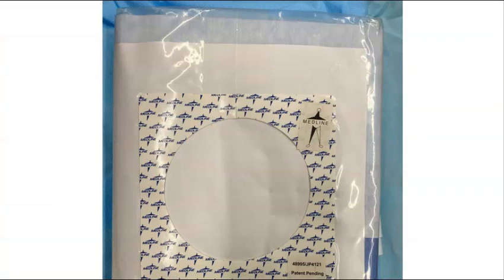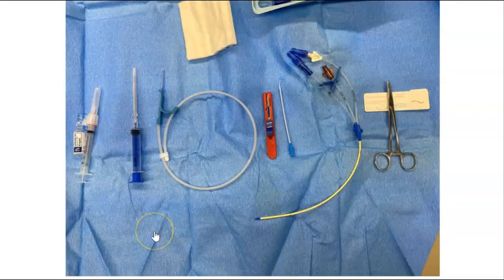Now that we have the patient positioned and found the best location for a central line, you will put on your gloves, gown, and hairnet using proper sterile technique. You will also place a sterile drape from your line insertion tray on the patient and place your sterile ultrasound probe cover. Next, you will prepare all of your equipment. We find the easiest way to prepare yourself for success is to lay out all of your equipment in the order that it will be used.